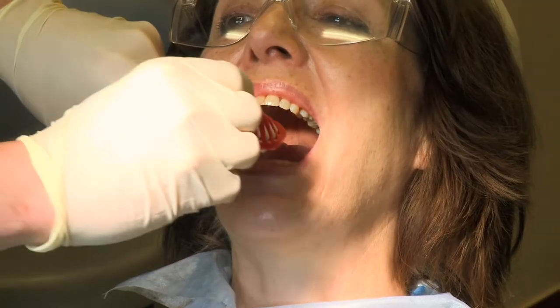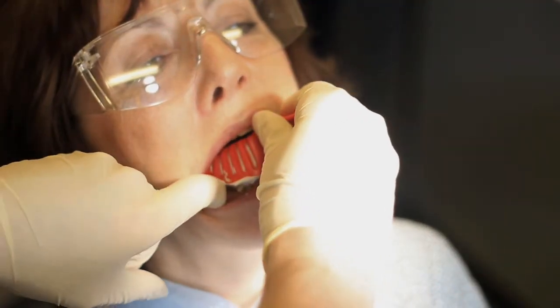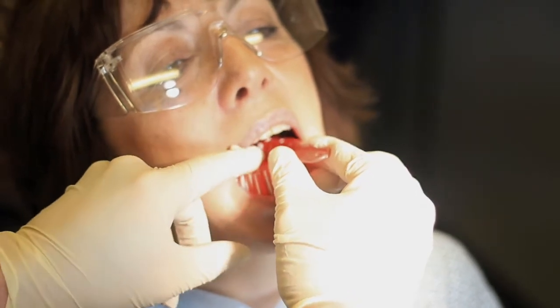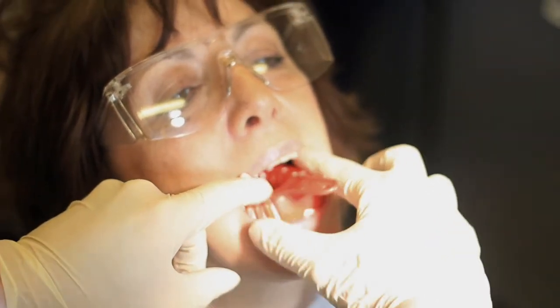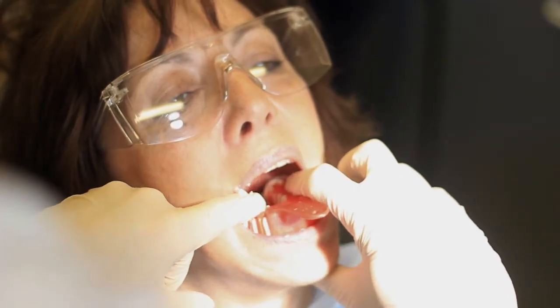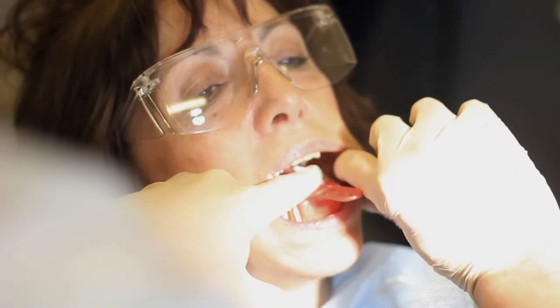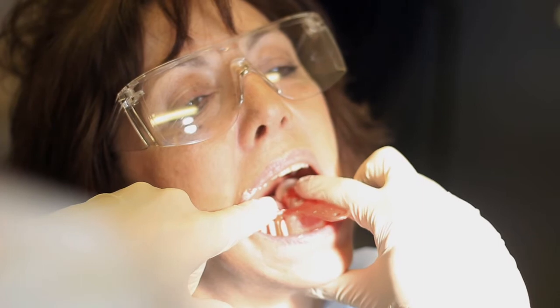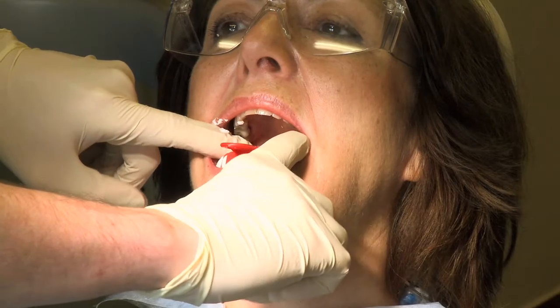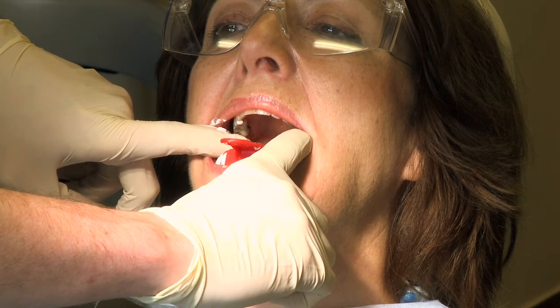So like we did before, we're going to stretch your cheeks out the way and gently squash it over your teeth. What we'll have to do, while we're putting the impression tray in, is just move your cheeks gently out the way as we squash it over. And then we're just going to gently stretch your cheeks over the impression so that we get all the teeth in the right place. And then it's going to take about 2 minutes for it to set, and then we'll take it back out again.